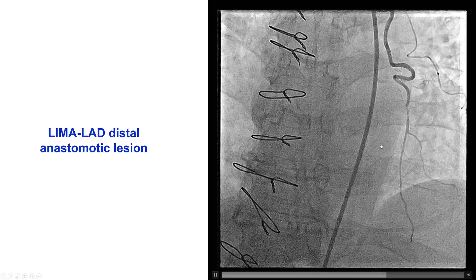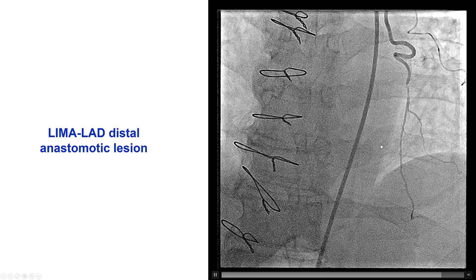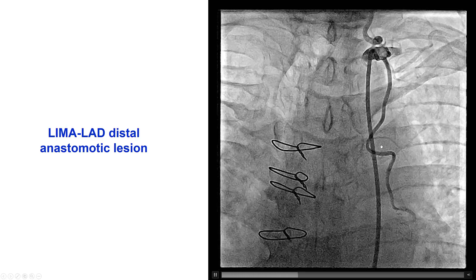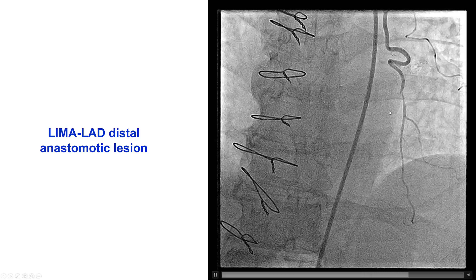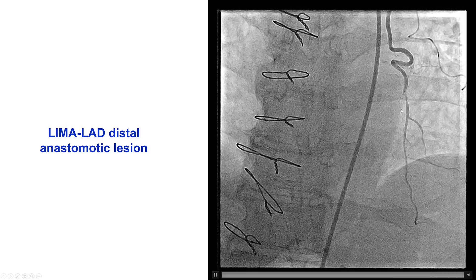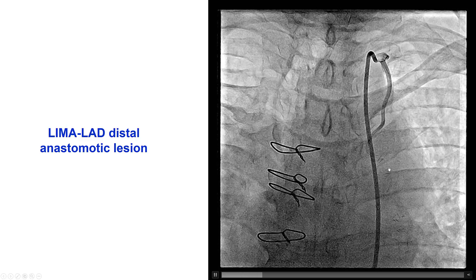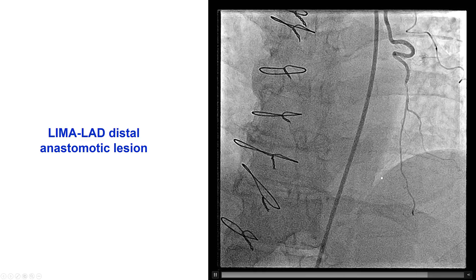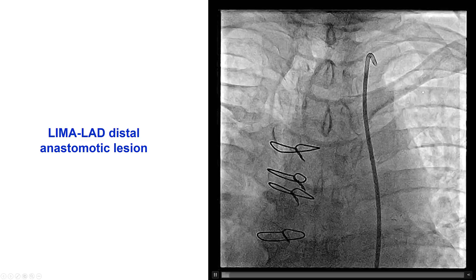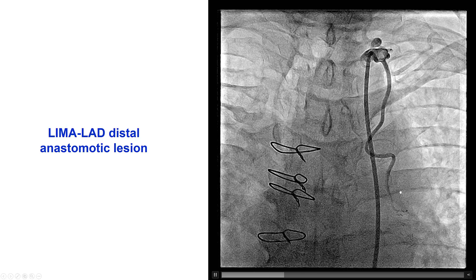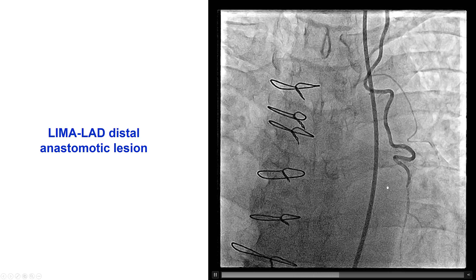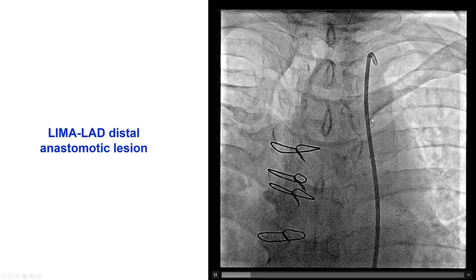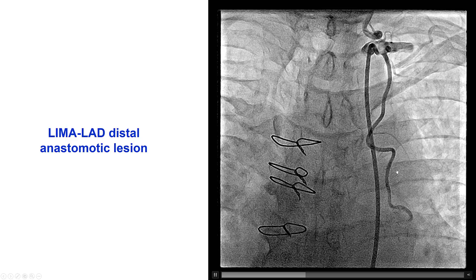The patient had an attempt at an outside institution to recanalize this lesion and deliver a stent. However, no stent could be delivered to this area because of the tortuosity. He was referred to our institution to either try to deliver a stent or, if that was not successful, to treat the native LAD CTO instead.